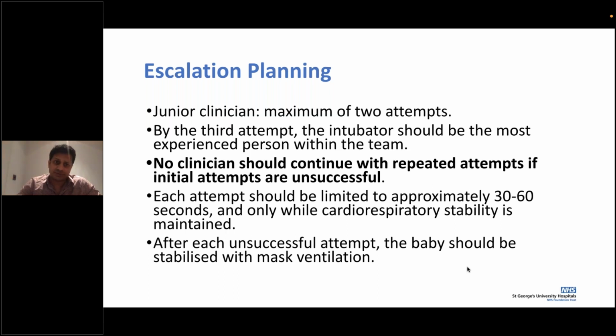Or holding a laryngoscope, where you may have practiced on a mannequin previously, but on an actual baby, it might be ever so slightly different. That initial experience is all building. It's not just getting the tube in, but getting a feel of what the preparation would be, or what to look out for.